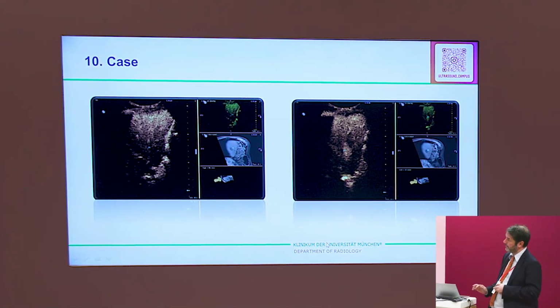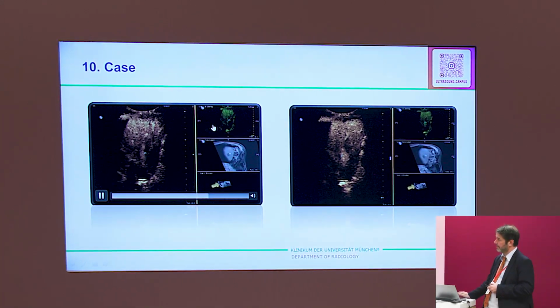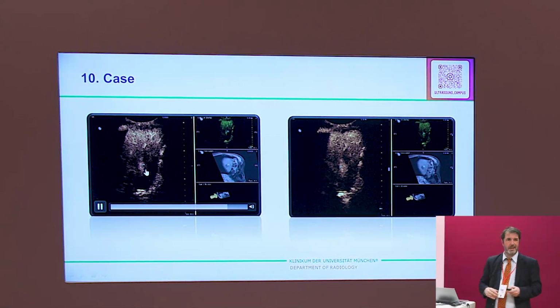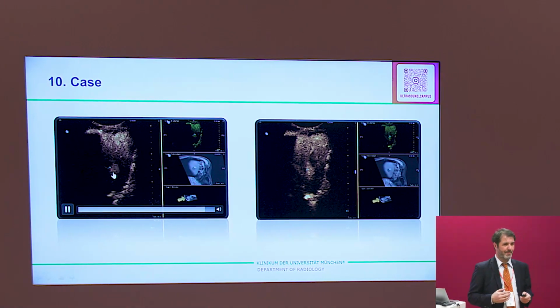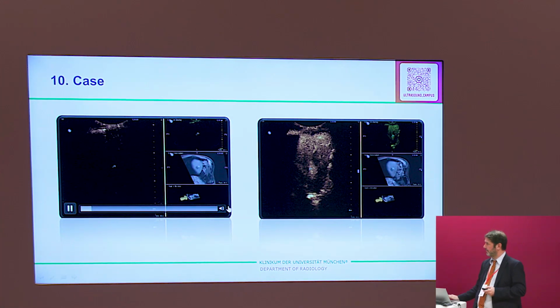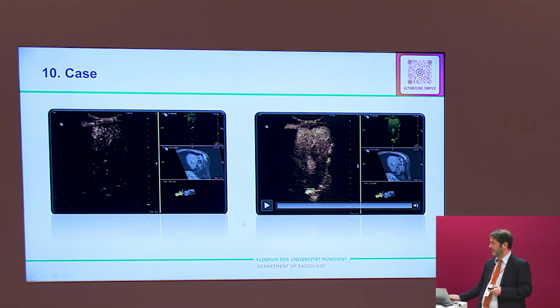And now you see this lesion is filled with contrast. You see? There. It takes quite a long time. And if you look later, still filled with contrast.